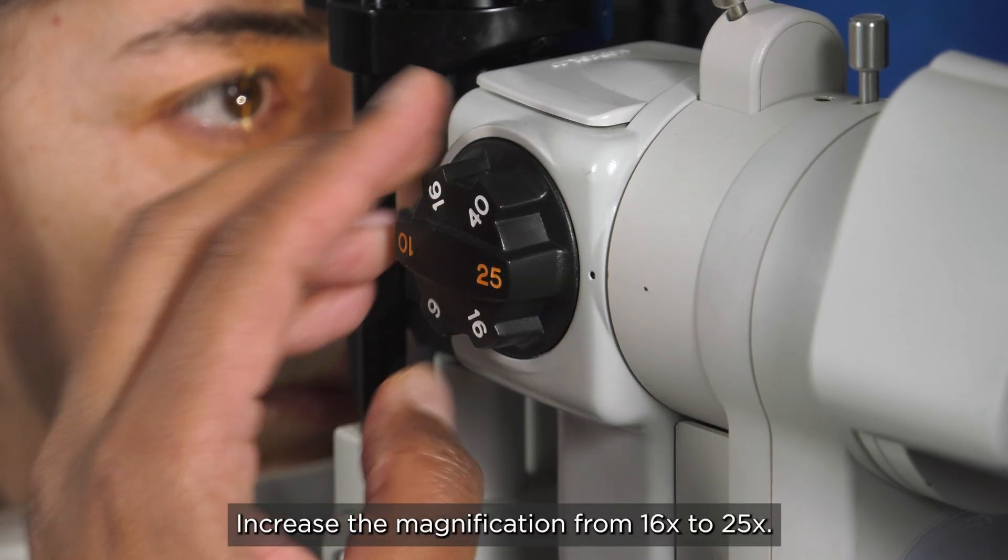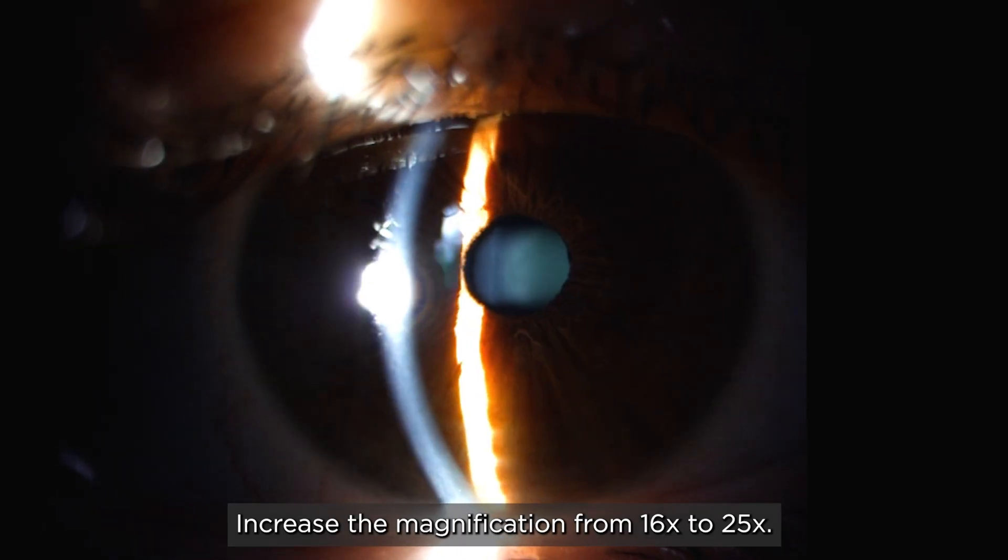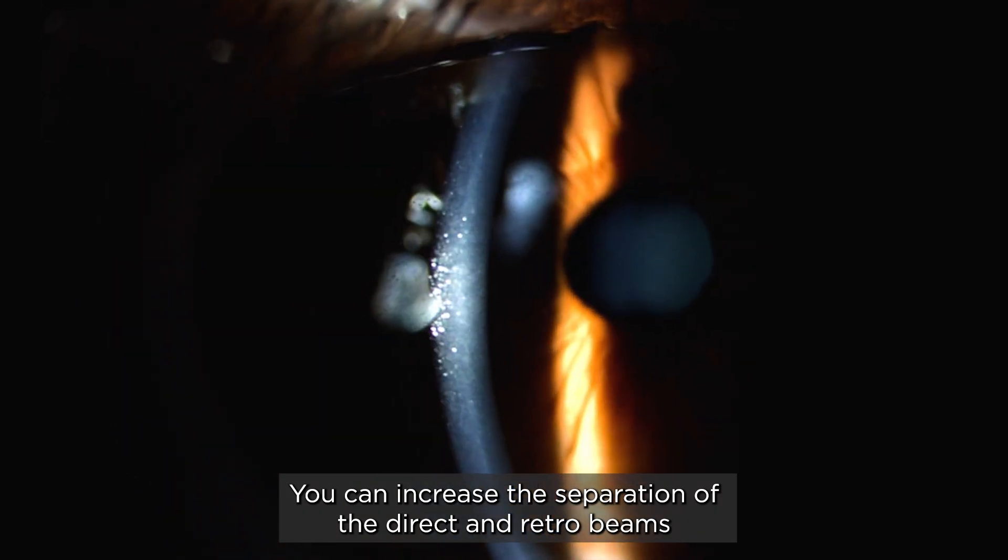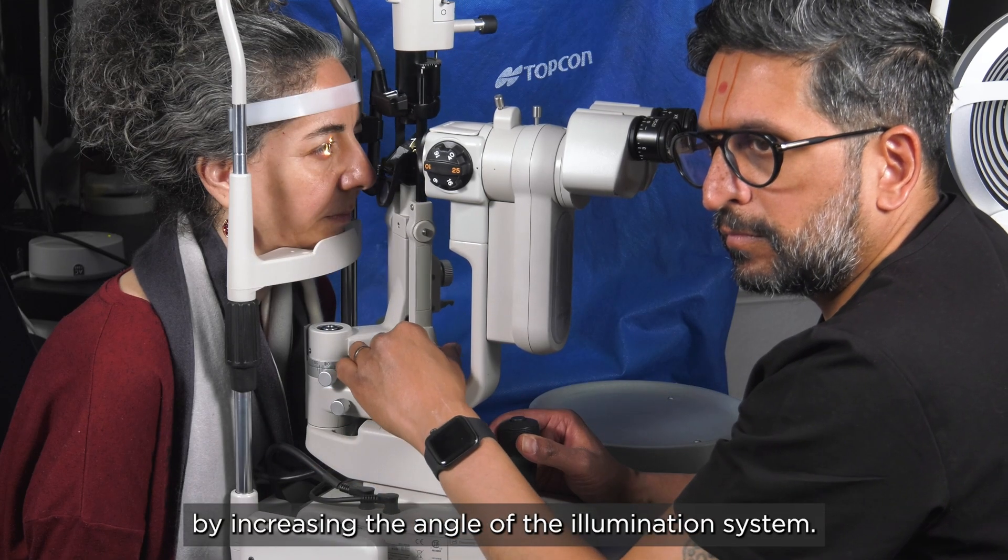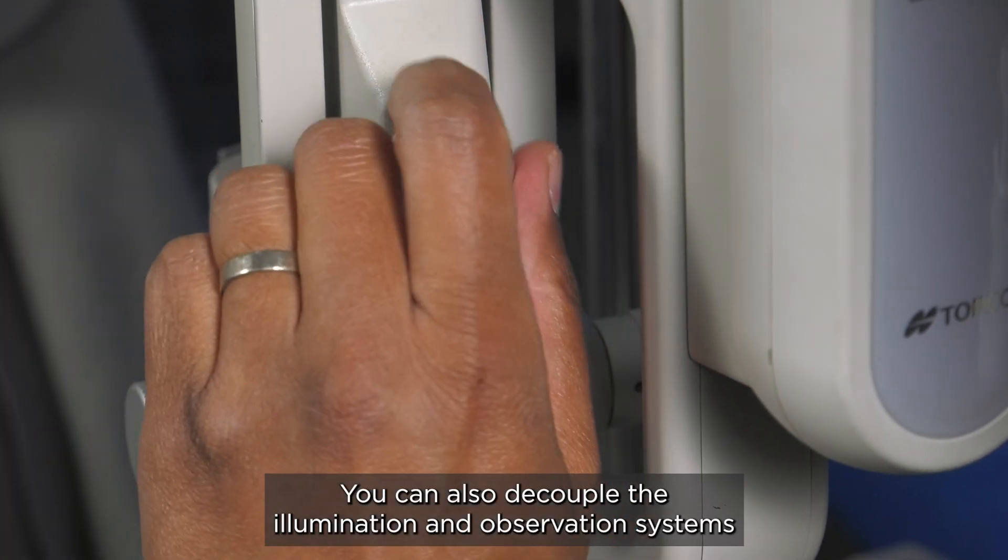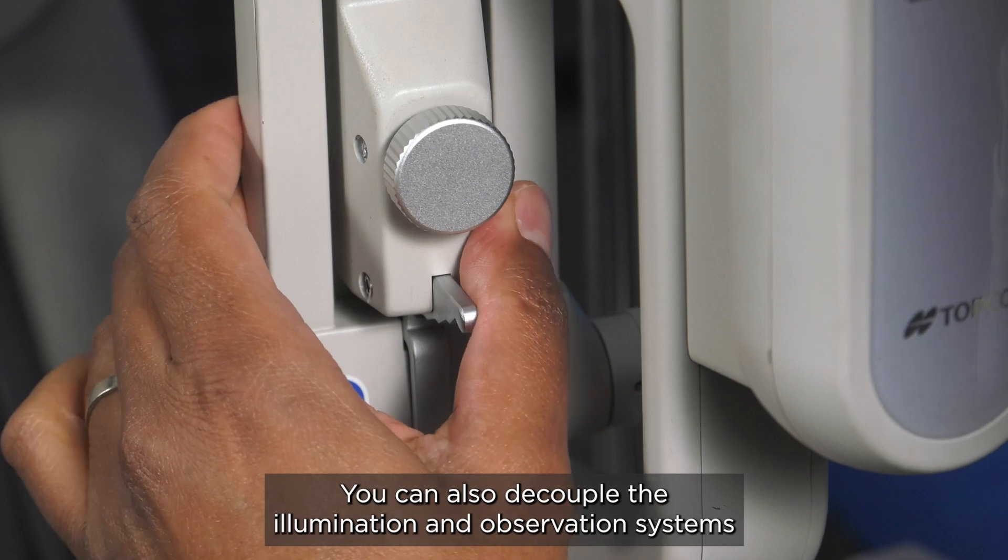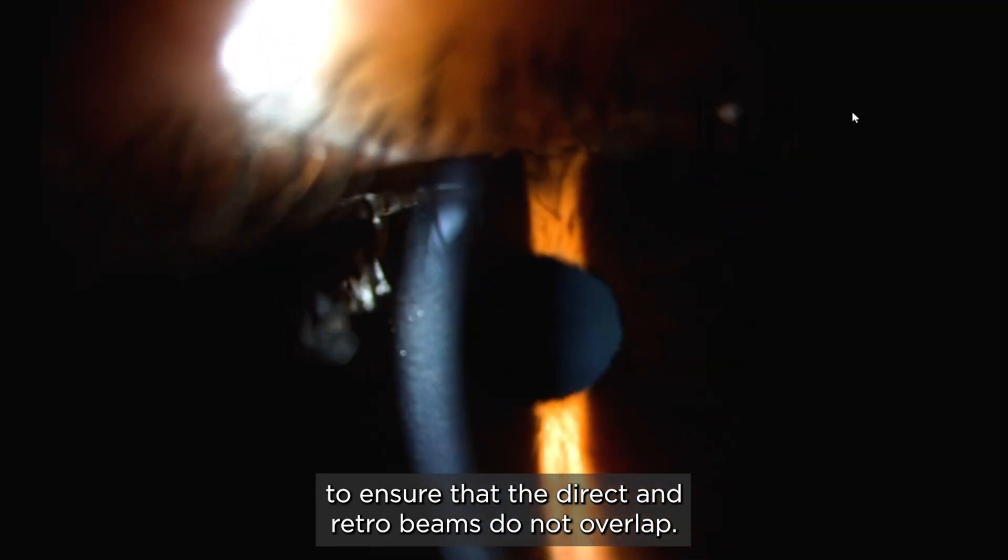Increase the magnification from 16 times to 25 times. You can increase the separation of the direct and retro beams by increasing the angle of the illumination system. You can also decouple the illumination and observation systems to ensure that the direct and retro beams do not overlap.